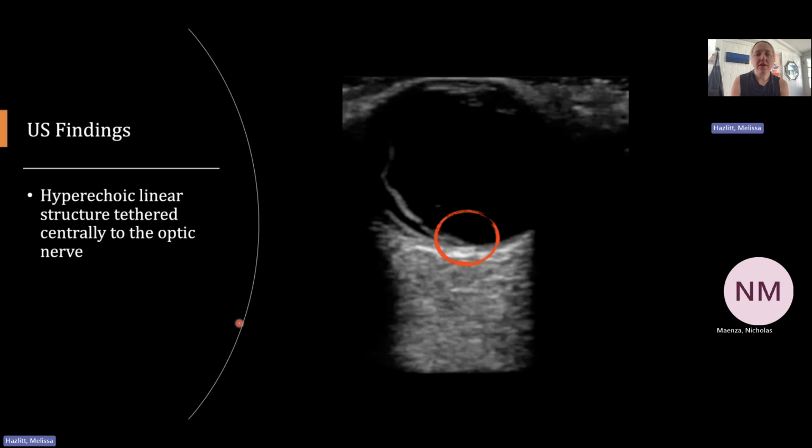And so then do you use the concept of macula on and macula off? Yeah, as far as temporally, if it's detached on the temporal side or not. Exactly, temporal side, it's macula off. And the idea being that if it's macula on, there's still some salvageable material, and it hasn't completely crossed over the macula, so there's still preservation of central vision.